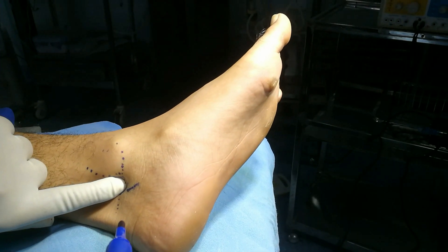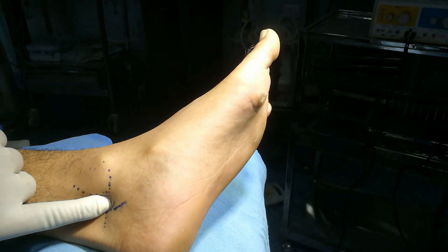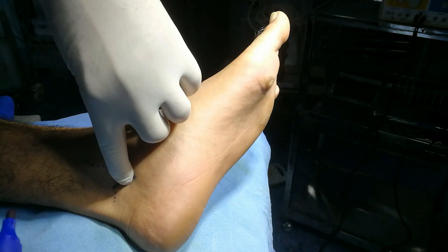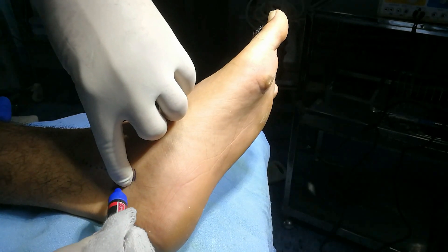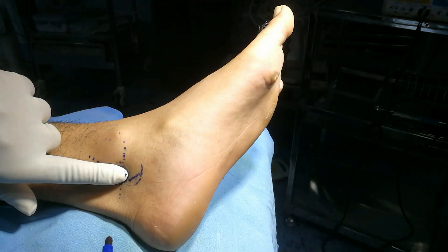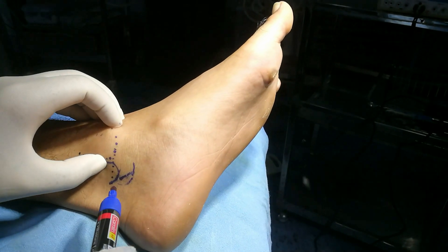One finger-breadth down and one finger-breadth anteriorly — so this is the point here. And this is the pulsating posterior tibial artery. Or you can say this is about 2 cm below and 2 cm anteriorly. You can also say 1.5 cm posterior and 1.5 cm down.